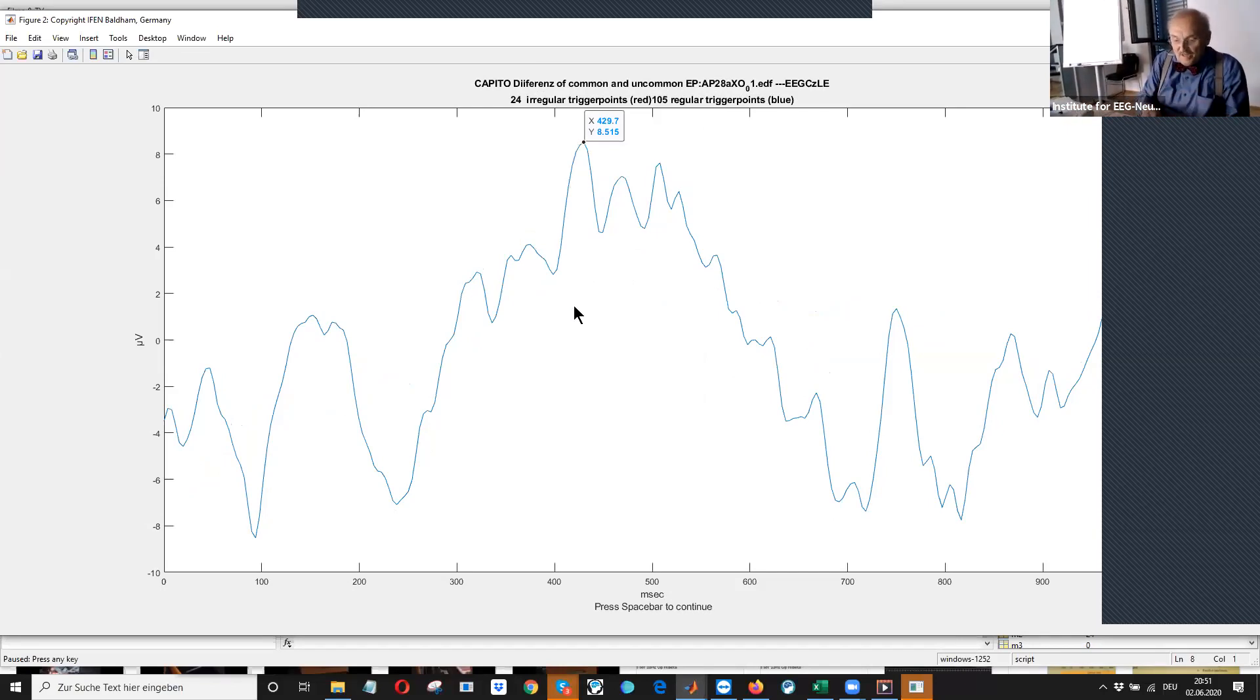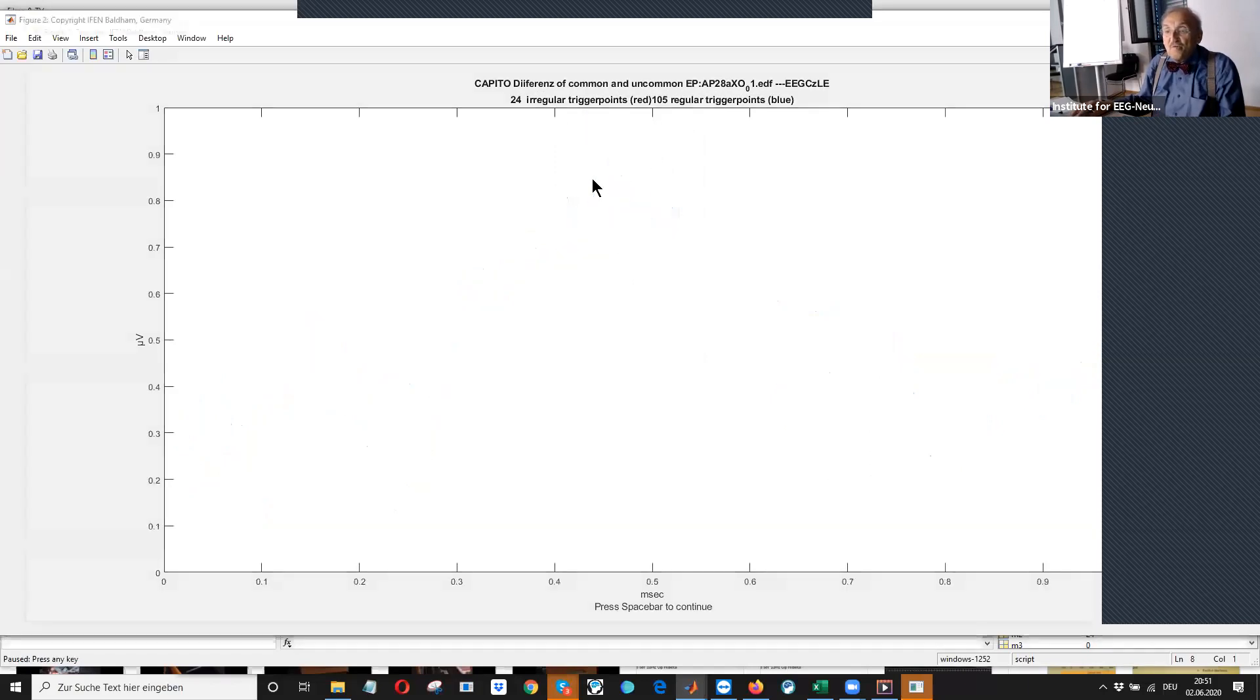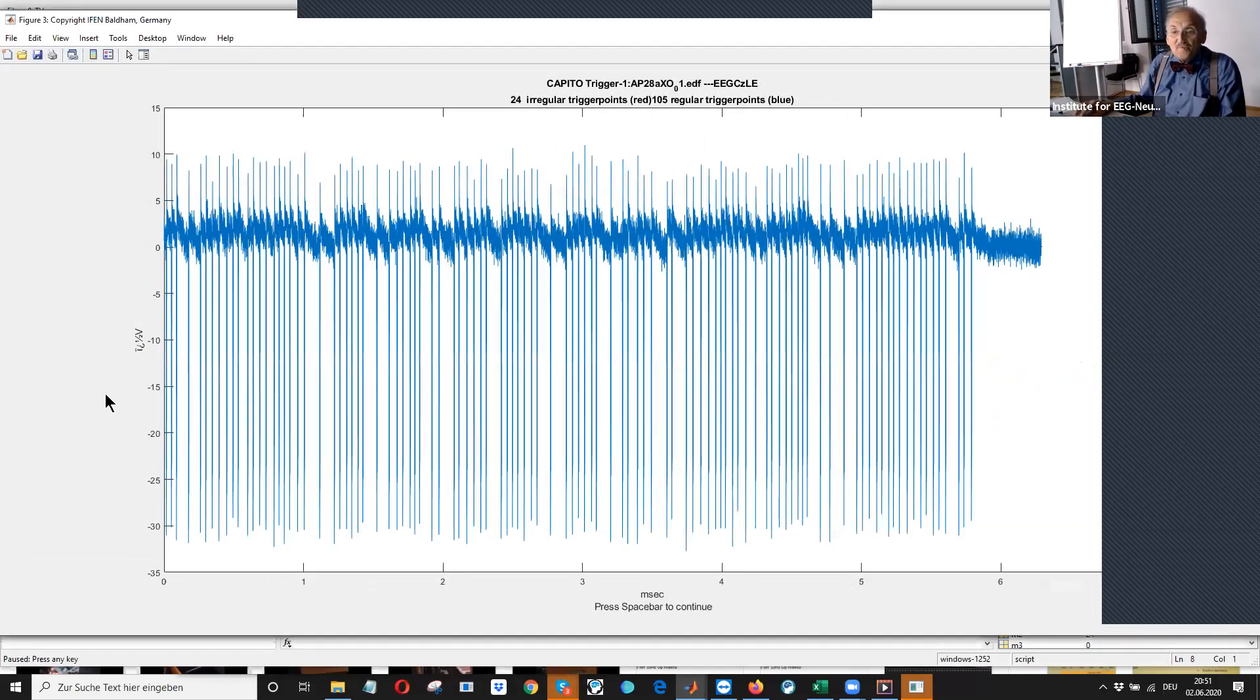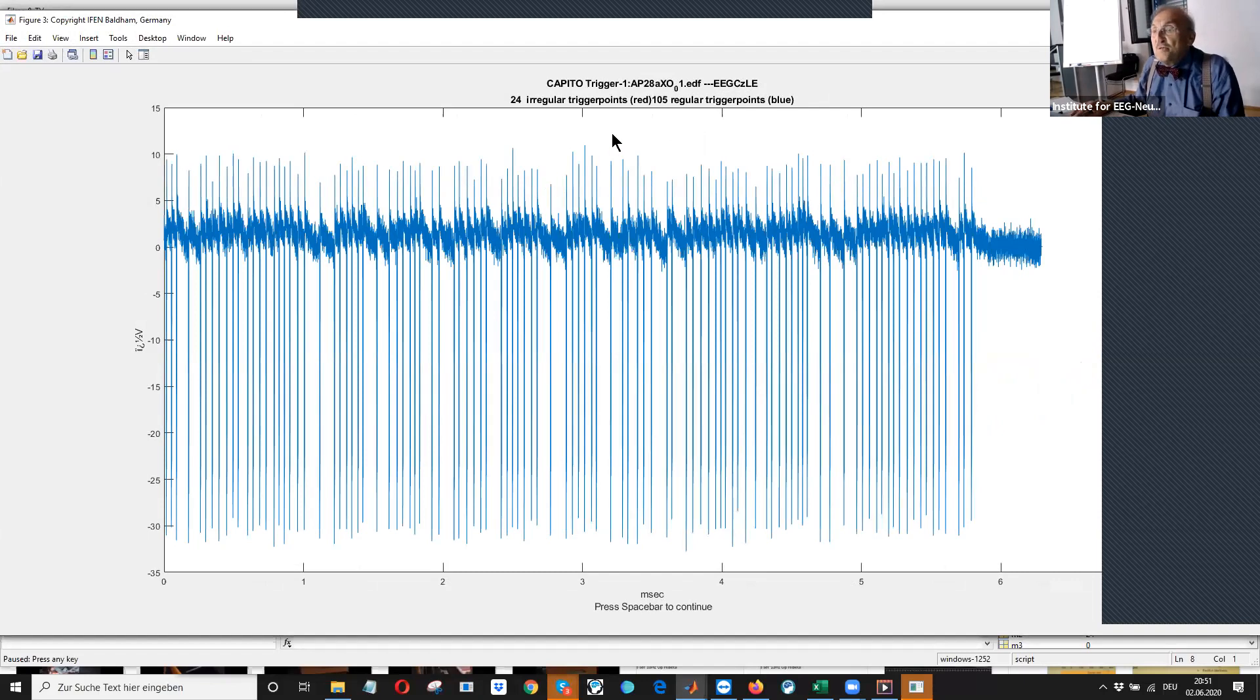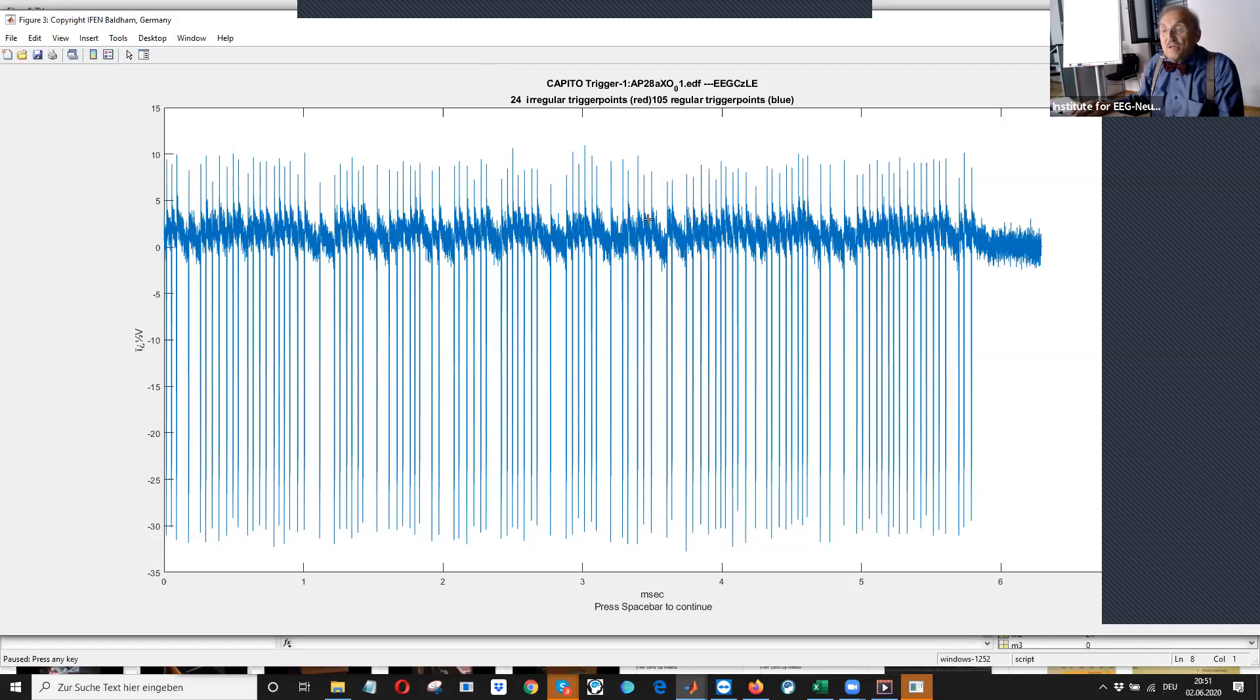What else can we do? We can, for instance, look at trigger one, whether the trigger one was fine. You can see we have had altogether 105 regular triggers and 24 irregular triggers. Here you see the regular triggers. Yeah.